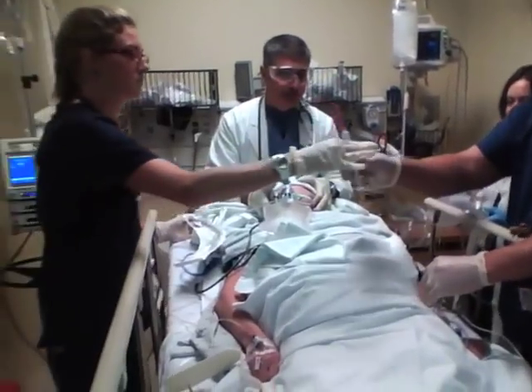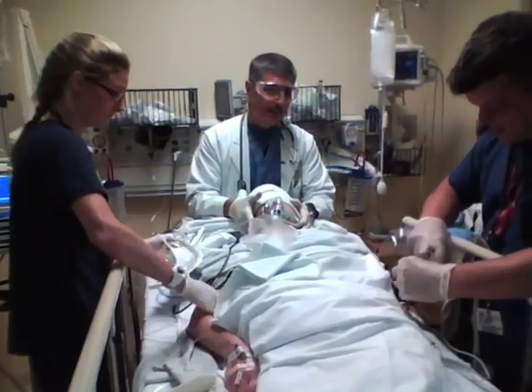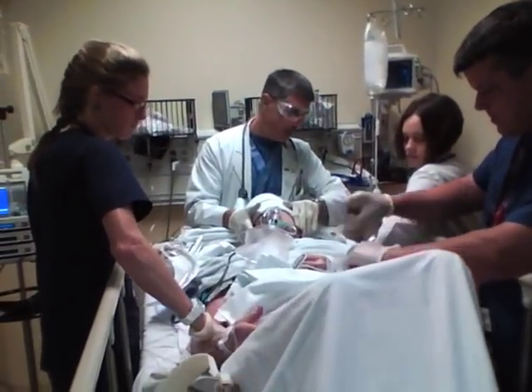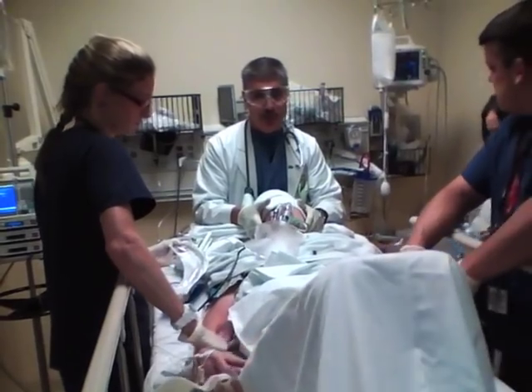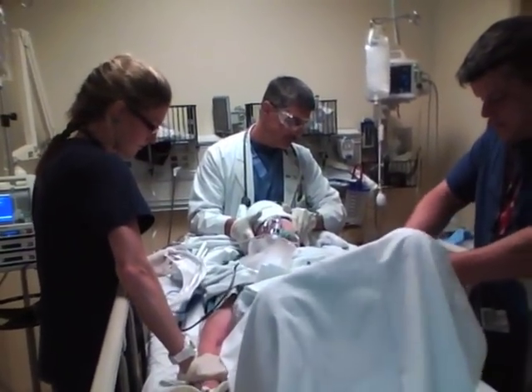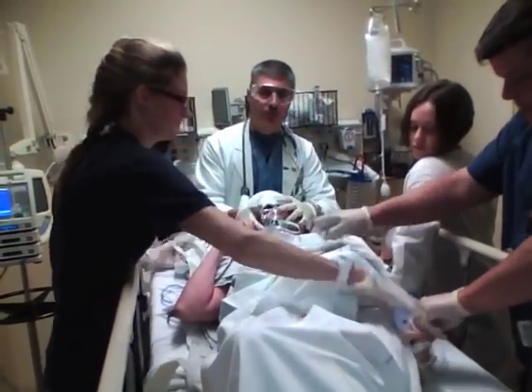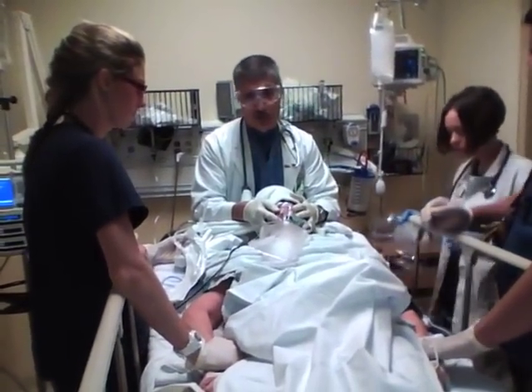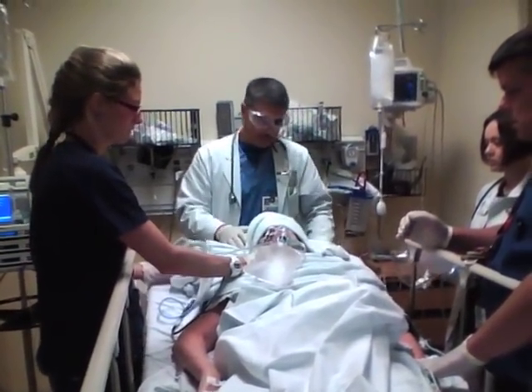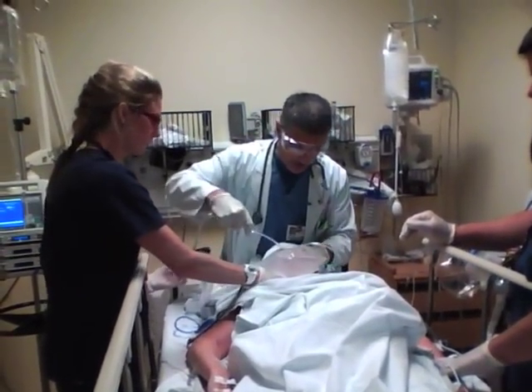Go ahead and push the rocuronium. The rocuronium is going in now. I'm going to wait about 15 seconds and then we're going to push the sedative — in this case, ketamine. Push the ketamine. Because she's in overdose, she's waxing and waning a little bit. If we weren't stimulating her, she'd go completely to sleep — she's really not protecting her airway. Go ahead and put a little bit of cricoid pressure on her. You can see how rapidly the medicines work.